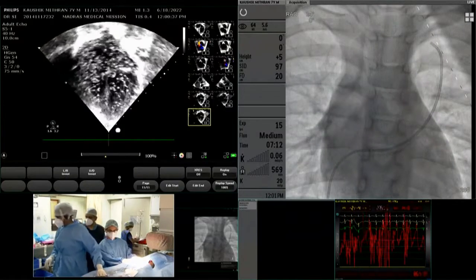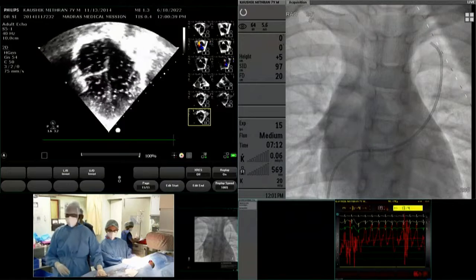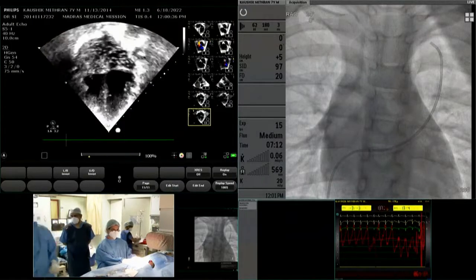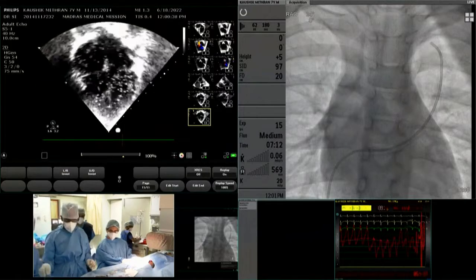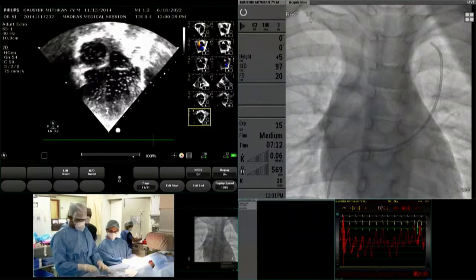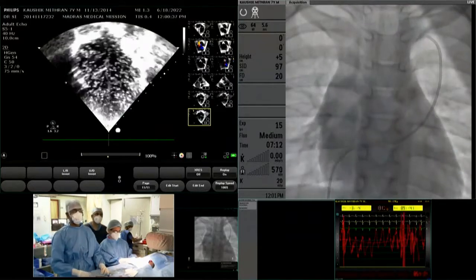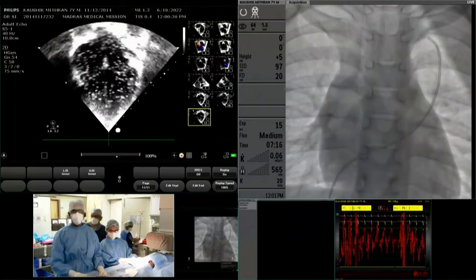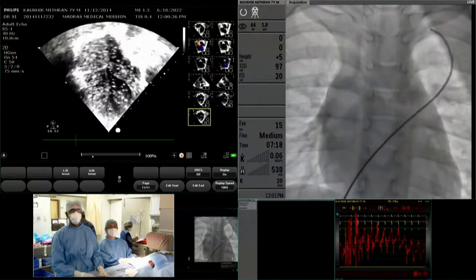Yeah, Nageshwar, it is not PAIVS, it was a hypoplastic right heart syndrome. Sorry for that, I was not there. So, right now, what we are planning to do is possibly a small balloon occlusion. I want a 12 into 3 Tyshak balloon.